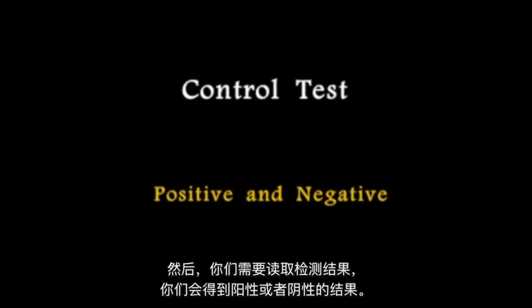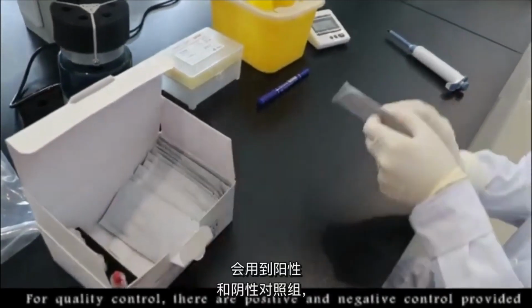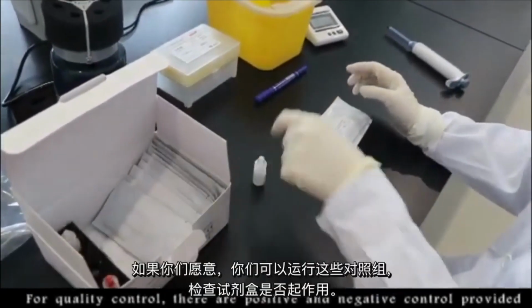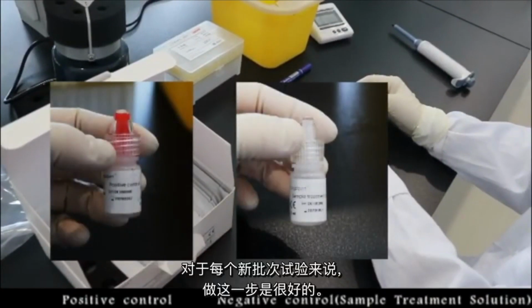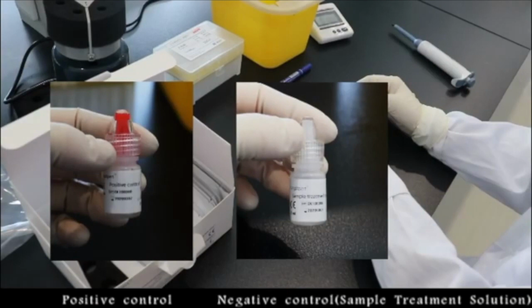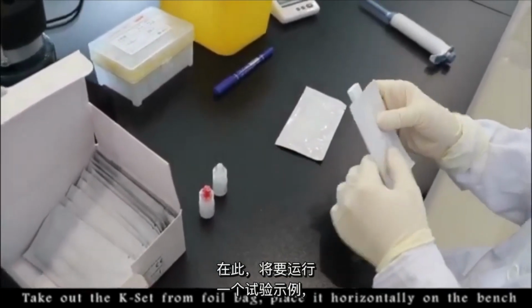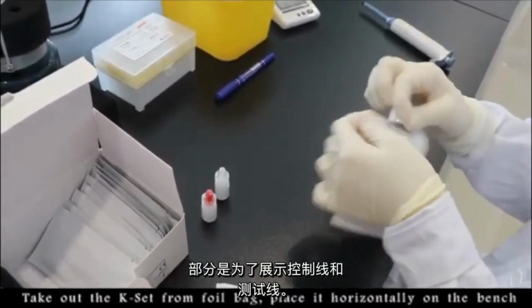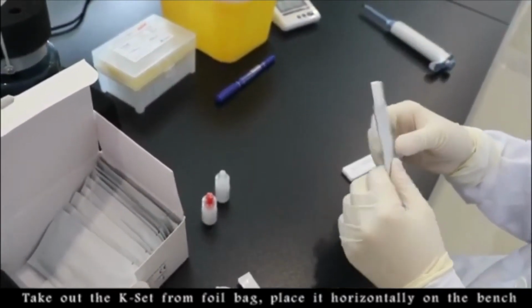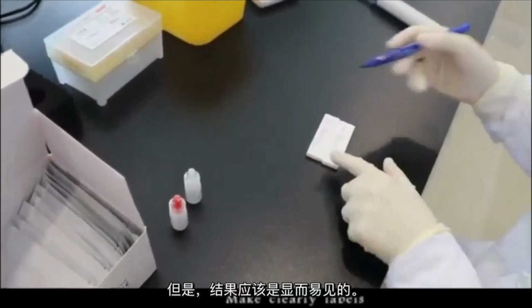And then you have to read the assay and you either get a positive or negative. There are positive and negative controls used, and you can run these to check that the kits are working if you so wish. And this is a good idea for each new batch. Here the example of these is going to be run partly to show the control lines and the test lines. Again, these should be labelled so you know which one's which, but this should be obvious from the results.